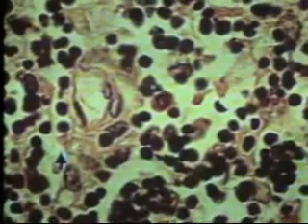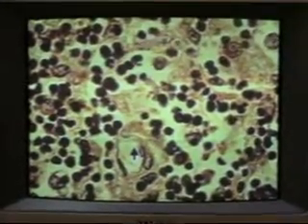And also, not perfectly, but there are probably several layers around it in other parts of the tissue. So these epithelial reticular cells provide a physical barrier between the antigens, because the antigens are in the blood, right? The antigens are circulating here in the bloodstream.